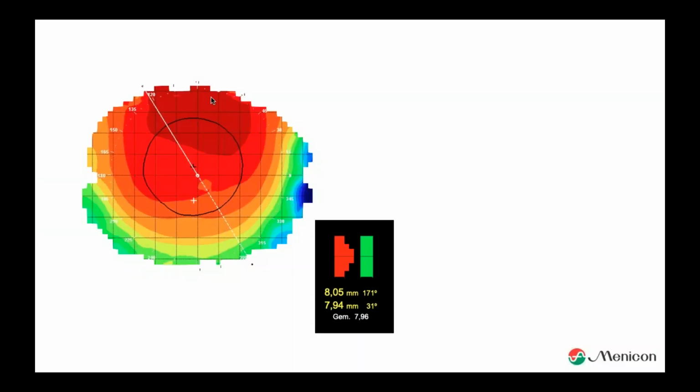And why? Well, there's a rule of thumb. A rule of thumb is that a contact lens, every lens, will fit in the periphery of the eye, but will center to the steepest part of the eye. And that's what you see. And half of the people attending saw that it's going superior. Here you see the beauty and the power of a topographer. Before fitting any lens on the eye, you know already what the behavior will be. So that's very important to understand. That's a really, really valuable tool of a topographer. So get used to doing more topography.